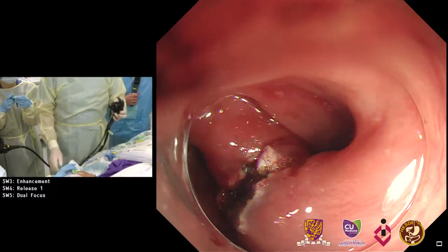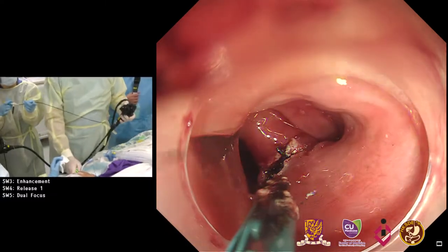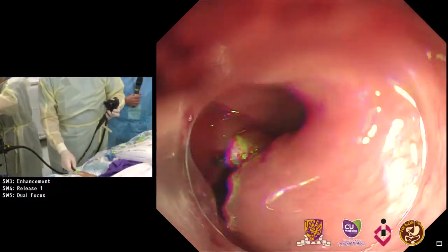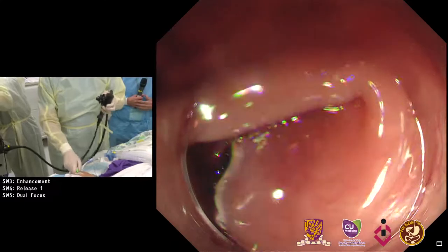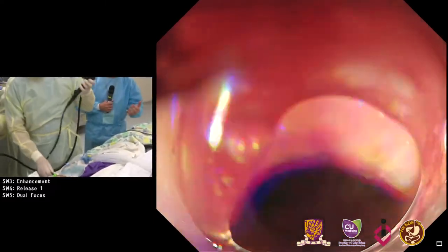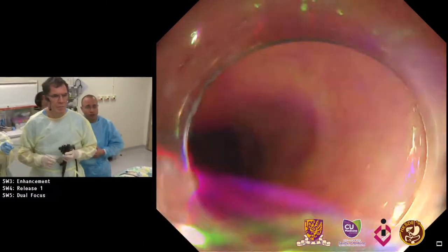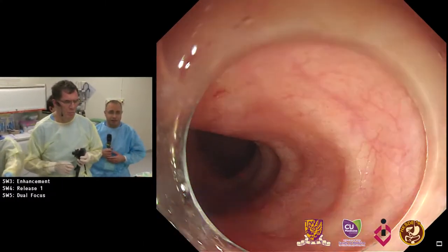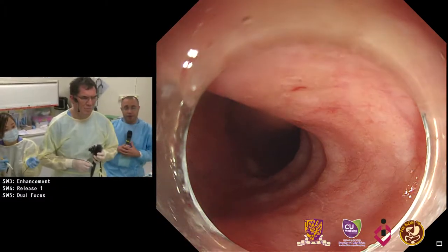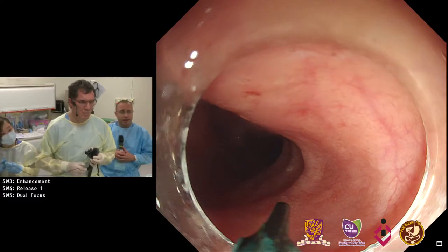With Z-POEM, we tunnel about one and a half centimeters proximal to the septum. We make a small mucosal incision, do submucosal tunneling, and get to the septum right away, then tunnel on both sides — one on the luminal side and one on the diverticulum side. This exposes the entire septum, and since it connects with the esophageal muscularis propria, there's no limit for the length of myotomy. I have experience with 25 cases over the last one and a half years. The outcomes are superb — we recently submitted 76 cases from a few of us doing this.